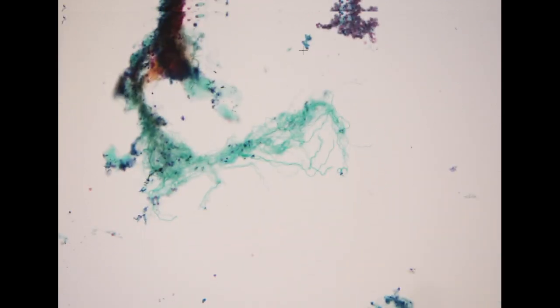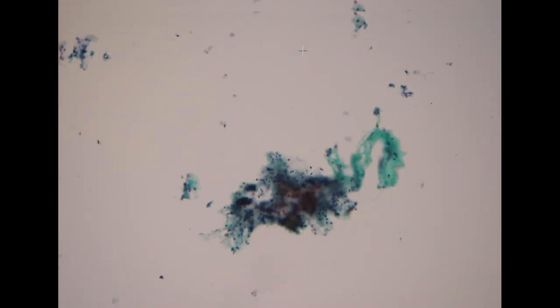So overall, for this specimen, we definitely see some desmoplastic type stroma along with just a single cluster of atypical cells with a glandular feature, and it's difficult to see through because it's very thick. But this is all we have.